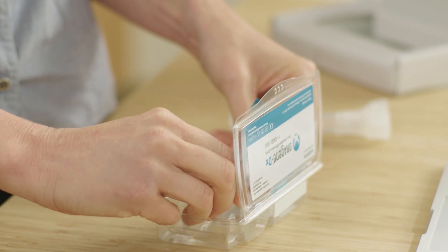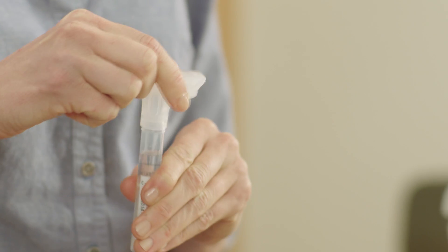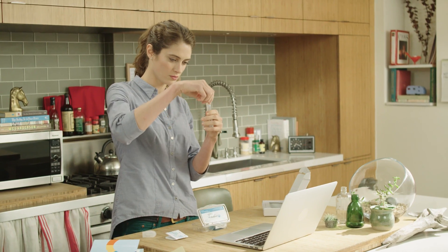Next, take the small blue cap out of the clear tray. Holding the tube upright, unscrew the funnel to remove it completely. Then screw the small cap onto the tube tightly. Shake the tube for 5 seconds to mix the liquid and your saliva together. This will preserve your sample across a wide range of temperatures.